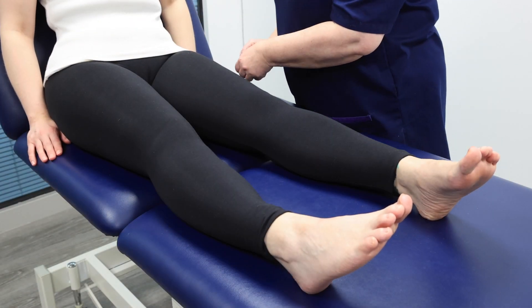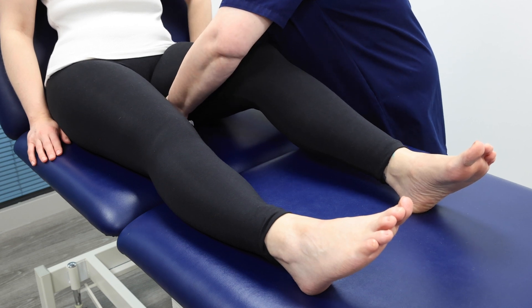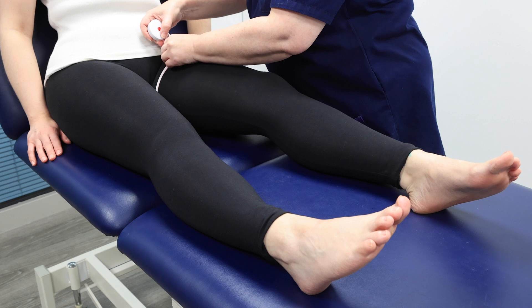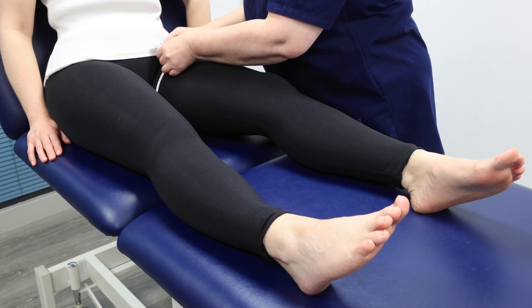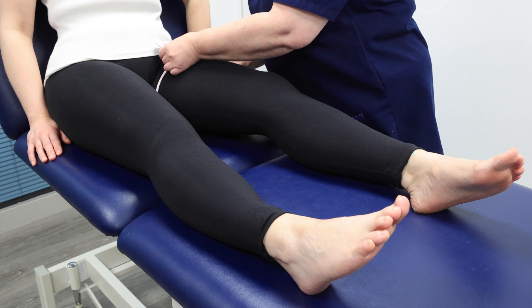Start by measuring the patient's uninjured leg. Measuring the uninjured side avoids unnecessary pain and discomfort. Measure the ring size using a tape measure from the groin, slightly oblique. In this case, the measurement is 62 centimetres.